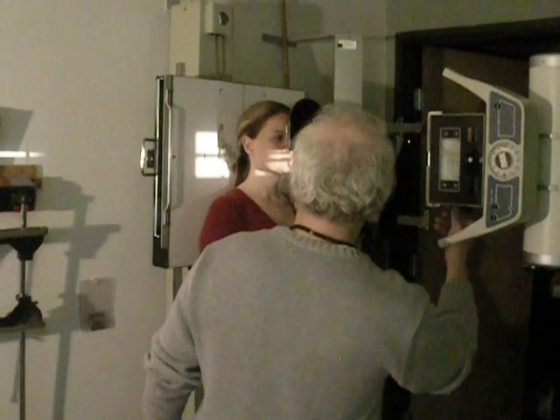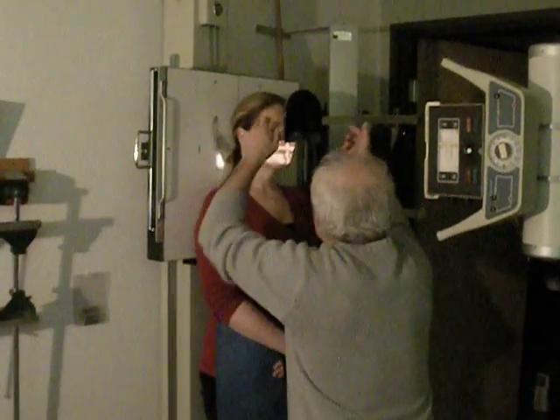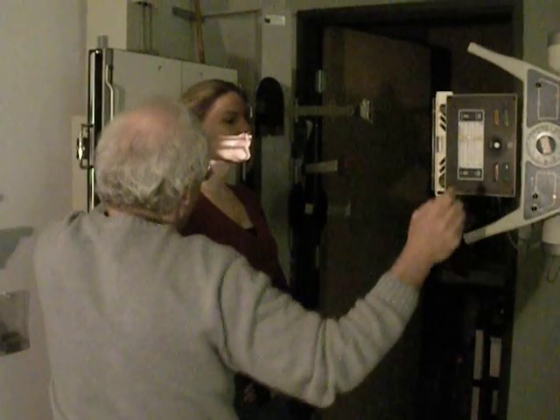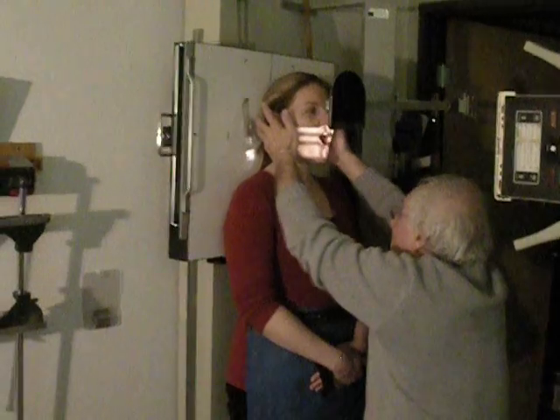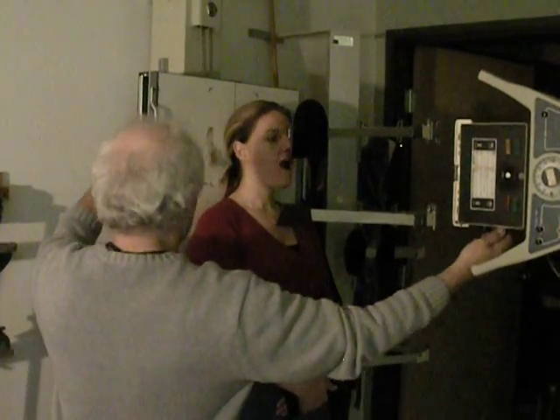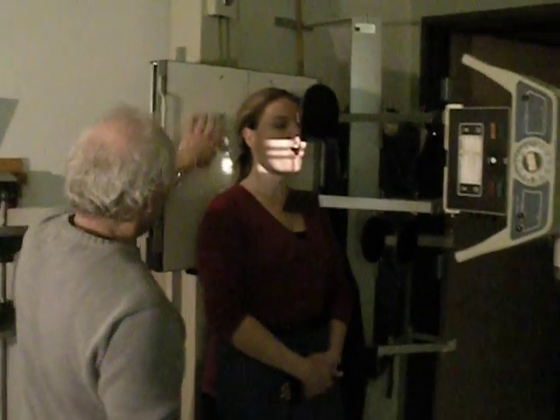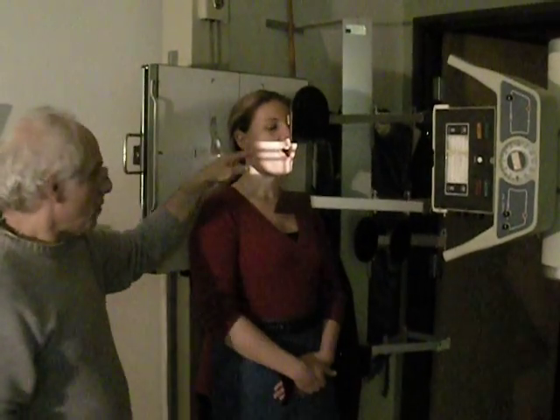And notice I haven't asked the patient to open her mouth yet. It's not quite necessary yet. So, let's have you now open your mouth as wide as you can. A little adjustment here. Same lines here. Check this one in front. We can add the thyroid shield. Add them if you got them. There. You got the marker in the field. Check both lines from front and sides. Don't move. Keep your mouth wide open. Beep.